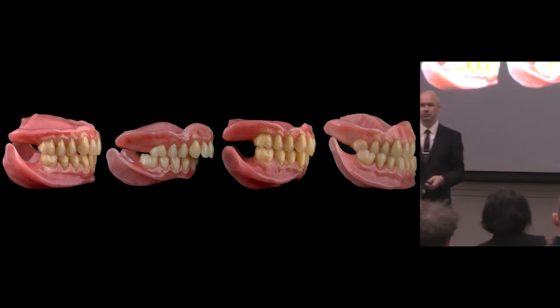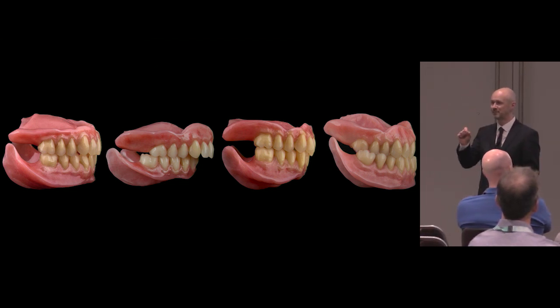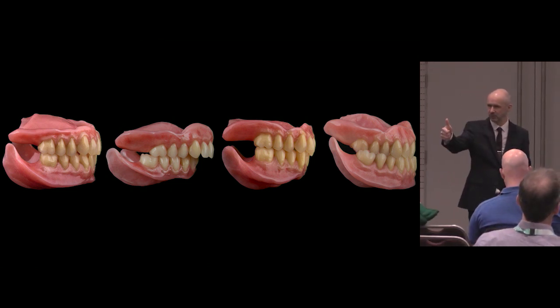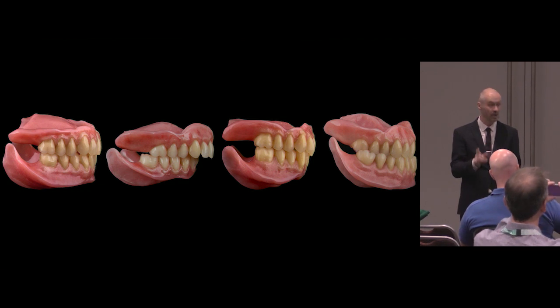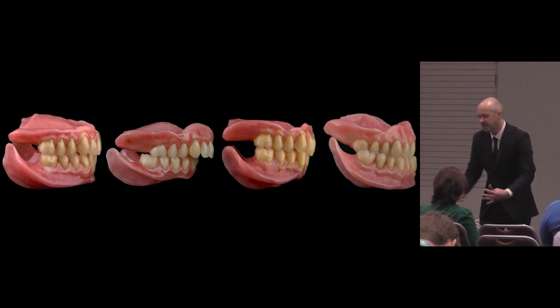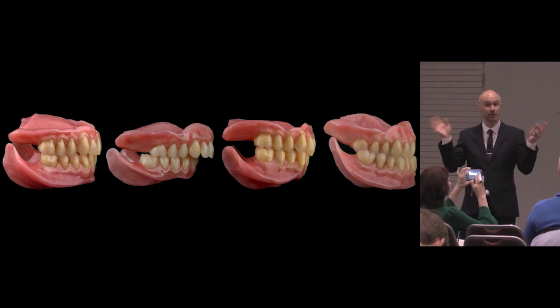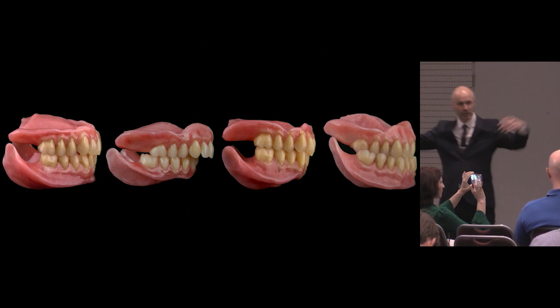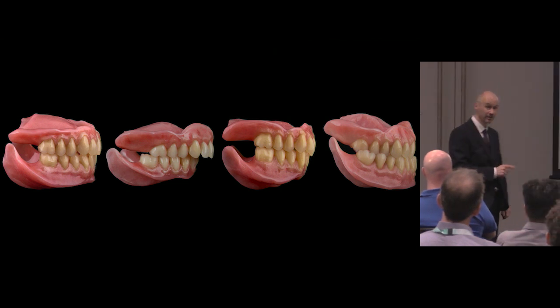So if the skeletal relationship is like that, I want to put the teeth back where they were naturally. And what we find is that it looks great when I put them back naturally, but I feel it's also really important for function, because the teeth have erupted from the bone up. They've been guided by the soft tissues and the tongue into these particular positions, and that's the neutral zone, the zone of minimal conflict between the musculature of the tongue and the cheeks. So the dentures are more stable as a result. I think that's dead important.